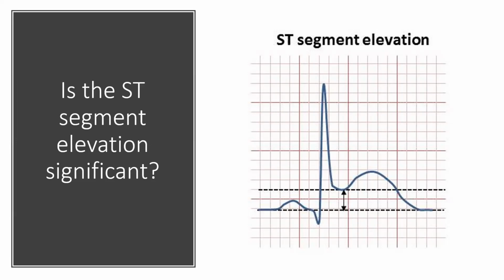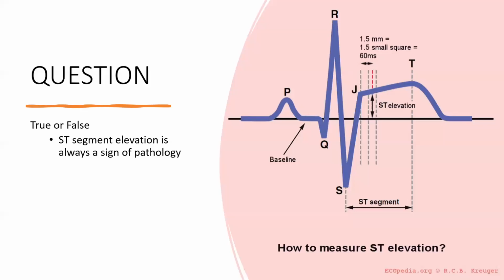ST elevation is not always a sign of pathology. It is one sign of STEMI, or it's the most significant sign of STEMI. But other conditions such as pericarditis might also cause ST elevation. There is also a condition known as early repolarization. It's something that we are not going to discuss today, but nonetheless, not all ST segment elevations are going to be a manifestation of myocardial infarction.